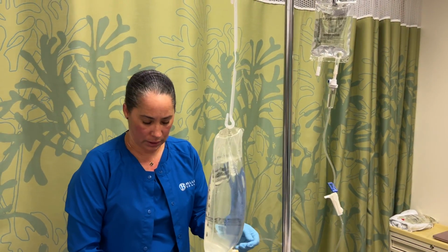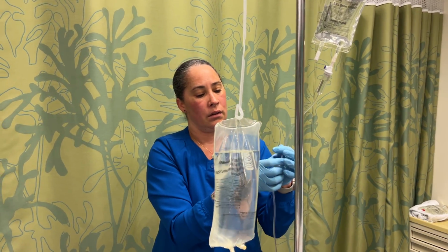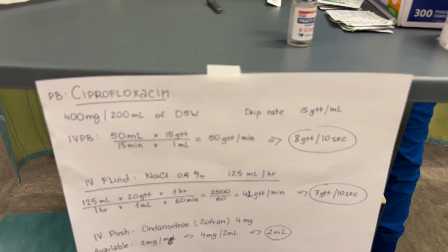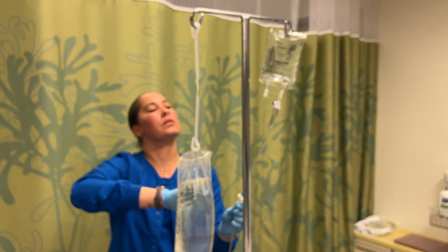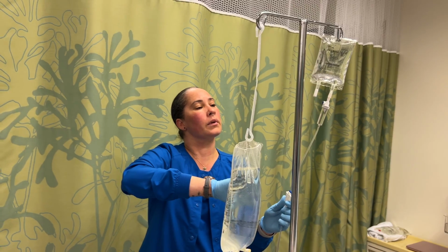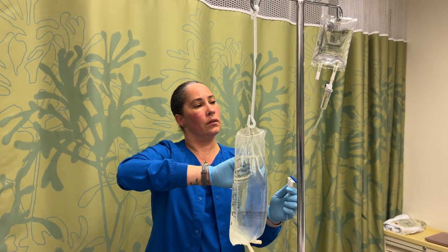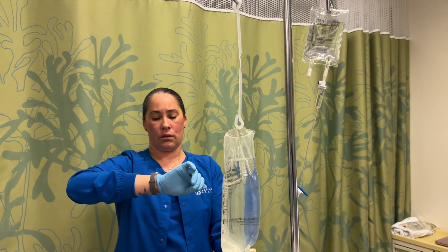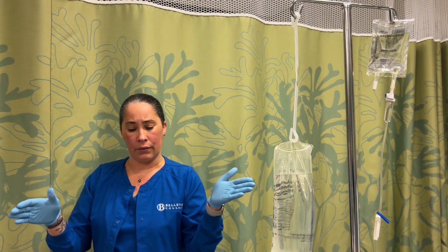So now that we're all set here, we're going to unclamp our antibiotic, and we are going to check the flow rate on that, which I said again is 8 drops per 10 seconds. So you are going to set your drops at 8 per 10 seconds. Okay, perfect. So that is running, everything's good to go.